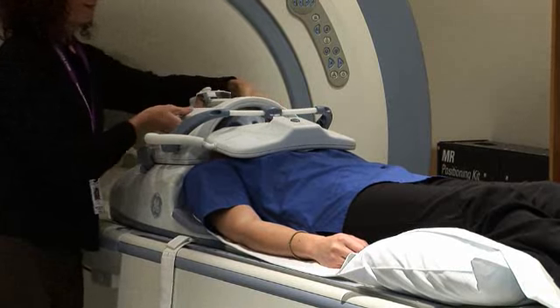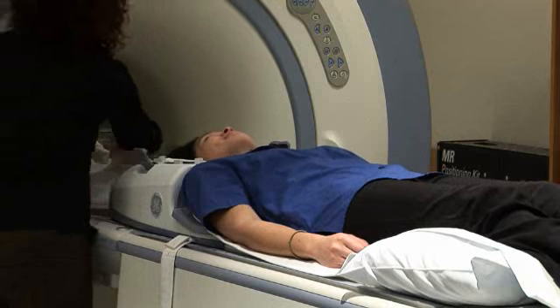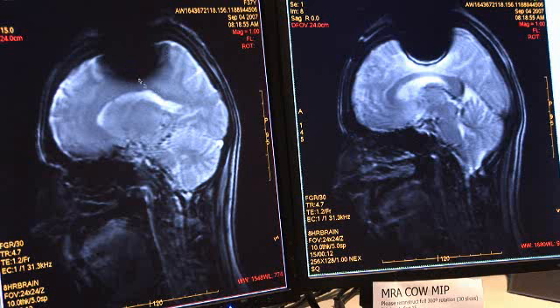Because of the nature of MR, each different tissue is assigned its own shade on the grayscale. So therefore, the contrast that's available, the contrast to noise ratio and the signal to noise ratio, which we can now achieve with a lot of these coils, is really superb in comparison to something like CT, where things are basically black or white. However, it is an expensive procedure and unsafe for people with pacemakers.